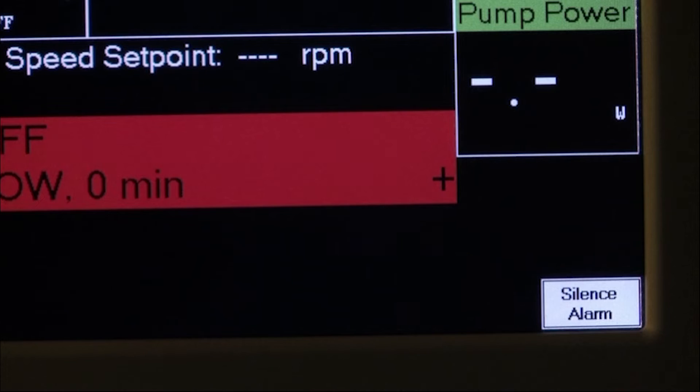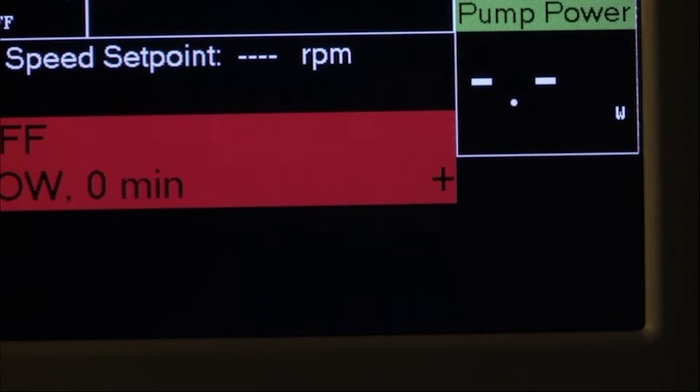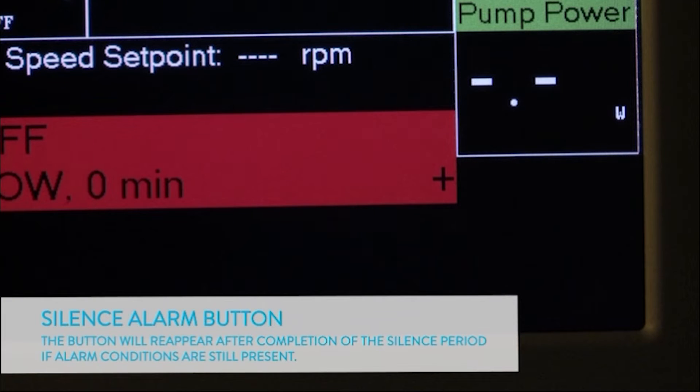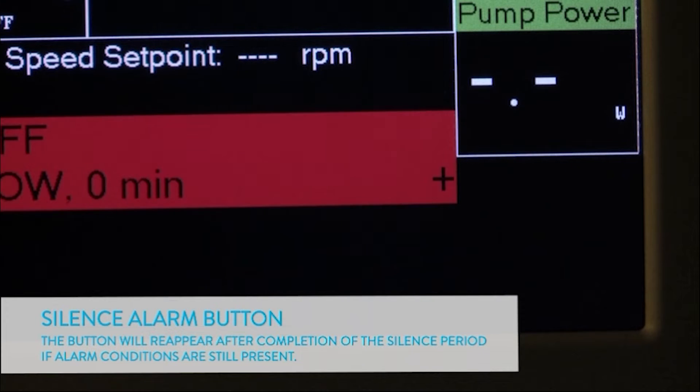The plus sign on the alarms banner indicates that additional alarms are active. They can be viewed on the alarm screen. The hazard alarms can be silenced for two minutes by pressing the silence alarm button on the lower right-hand corner of the screen. The button will reappear after completion of the silence period if alarm conditions are still present.